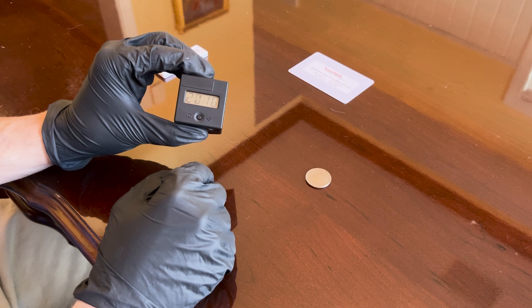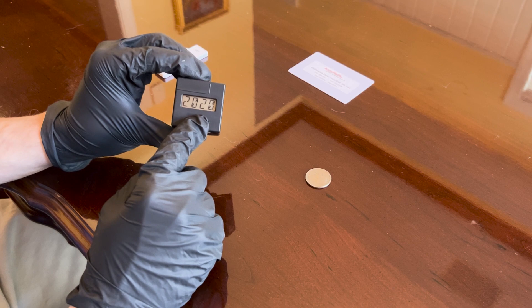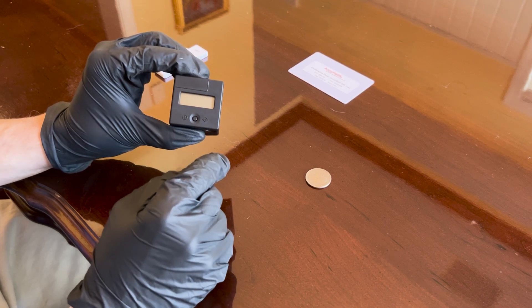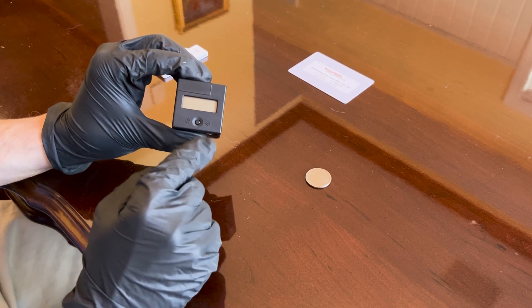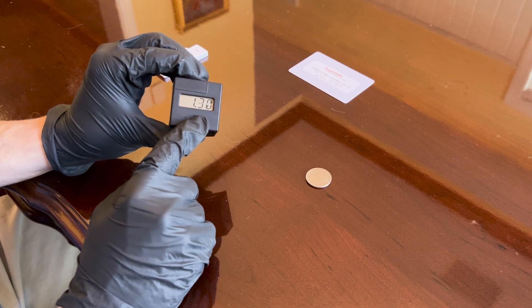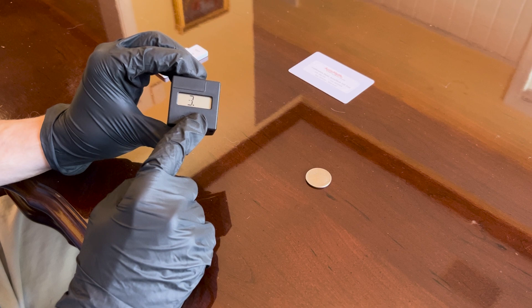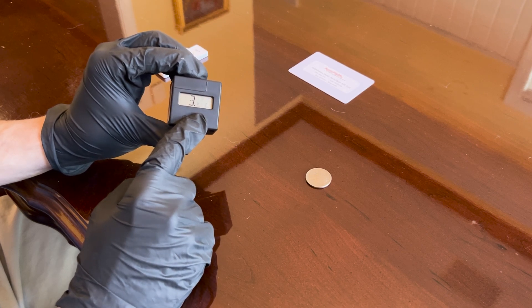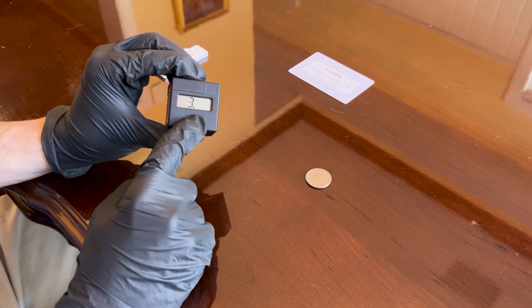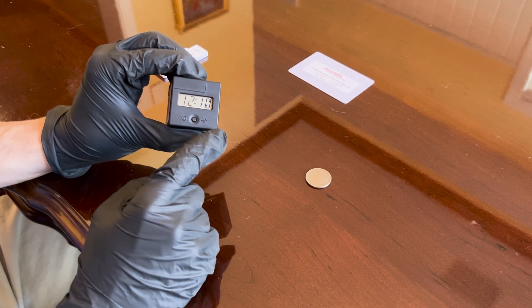Press and hold the central button so that the year begins to flash. Scroll through the different year values and select your current year. Press and hold down the button and the black box device will store that year. Next, it will move on to the month and date — select your month and then your day. Here you can see I am scrolling and selecting my current date, and I'll repeat the same process for the time.